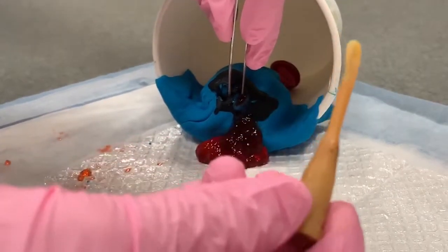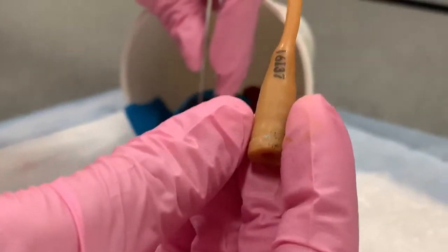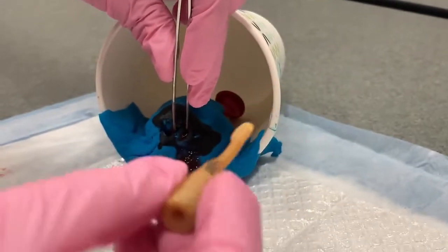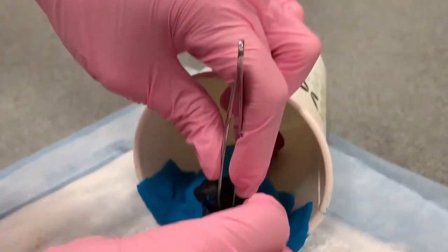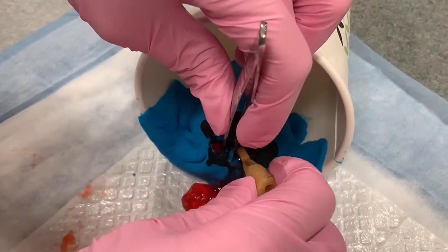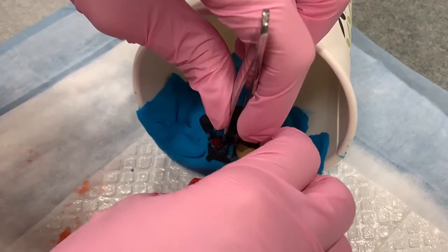This is how the catheter looks. There's a balloon at the end. You will insert this into the incision site. It should fit into the cavity of the cyst.